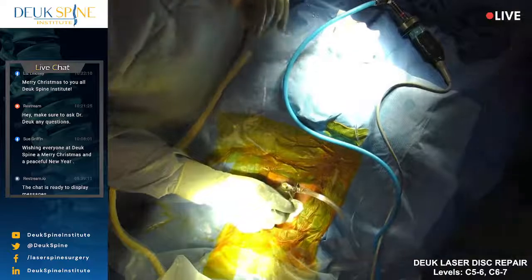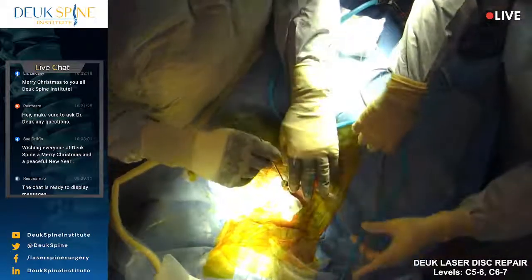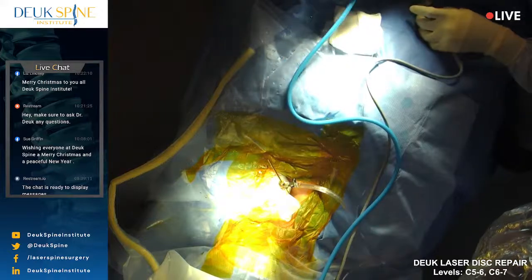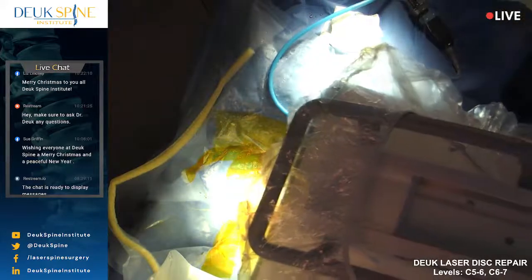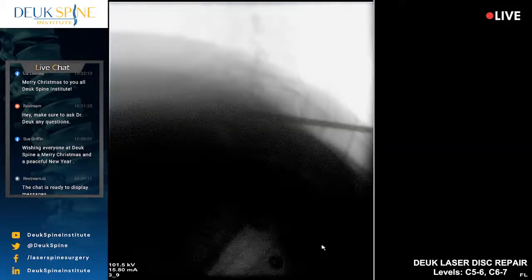All right, at this point, we're going to move from the C6-7 up to the C5-6, okay? So to do that, we're going to reposition the fluoro, the C-arm, which is an X-ray machine, and we're going to get some views of the side of the spine. And I'm going to basically take the tube out, and then I'm going to march the dilator up to the next disc.